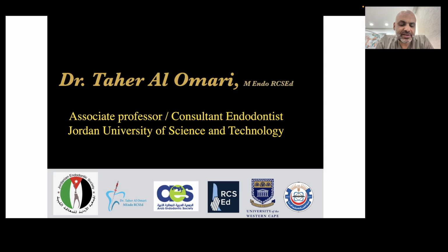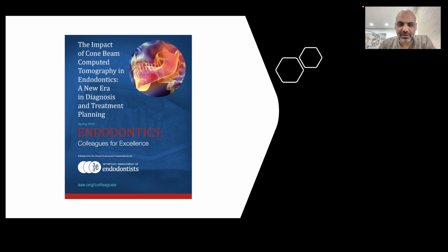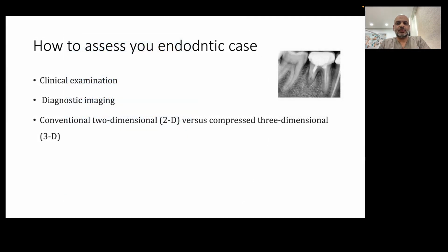المحاضرة اليوم حتكون عن CBCT, how to read and how to assess the CBCT and why to use it. ابتداء محاضرتنا تعتمد على guidelines for the American Endodontic Association. We start with how to assess our endodontic case.